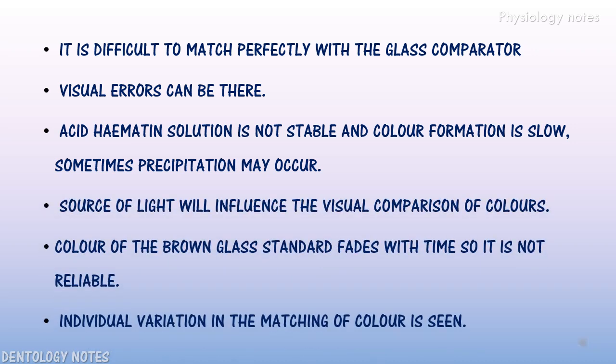It is difficult to match perfectly with the glass comparator. Visual errors can be there. Acid hematin solution is not stable and color formation is slow. Sometimes precipitation may occur. Source of light will influence the visual comparison of colors. Color of the brown glass standard fades with time, so it is not reliable. Individual variation in the matching of color is seen.